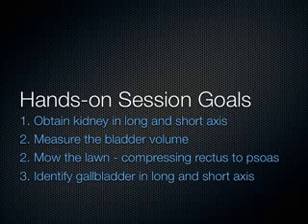Any questions about this talk? Okay. Yes? Putting the right leg as far as you can over the left, why? I don't, yeah, that's a great question. That comes up all the time. Why would you put the right leg over the left leg?